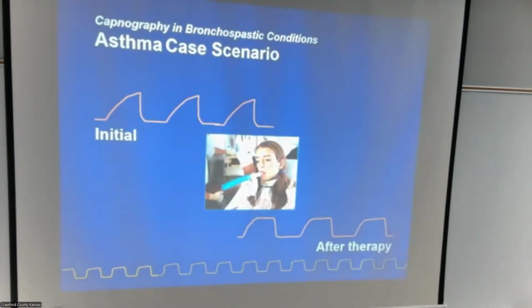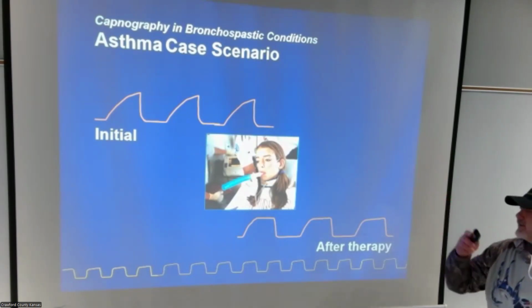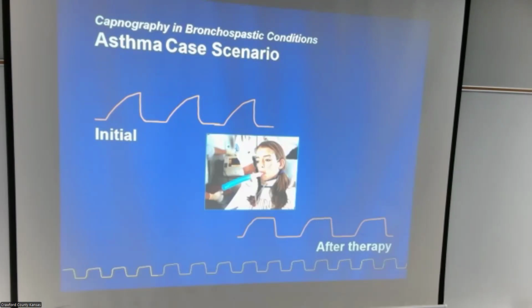Now, if they all looked like that, that would be great. We would never miss it. But anyway, after our breathing treatment, we should go from that to this if God aligns everything for us. And the patient should go, "I don't want to go to the hospital." That's kind of unusual. We let them out.